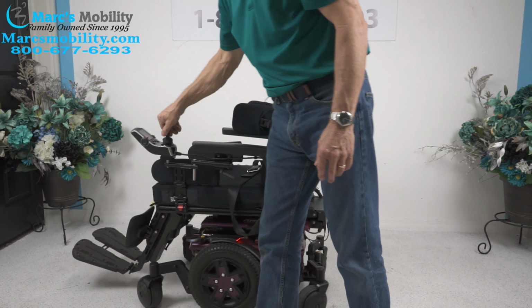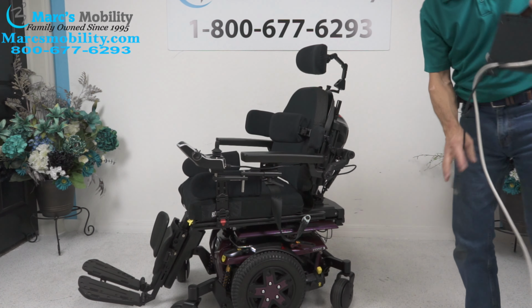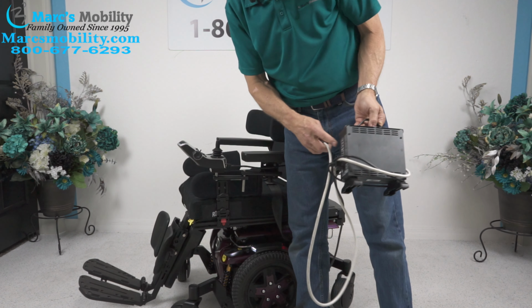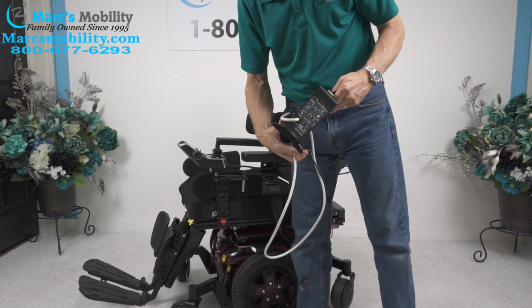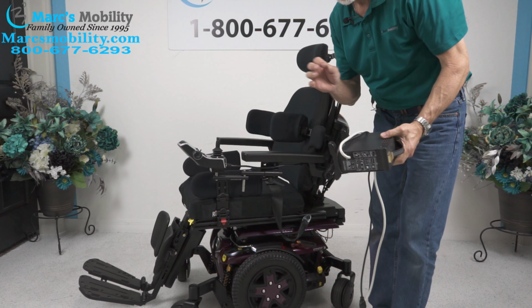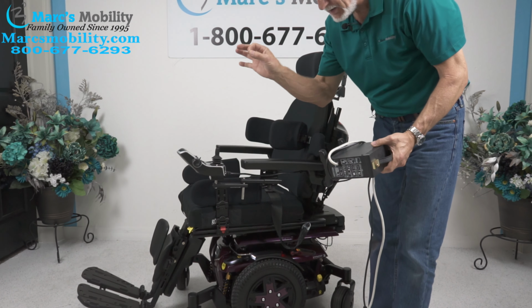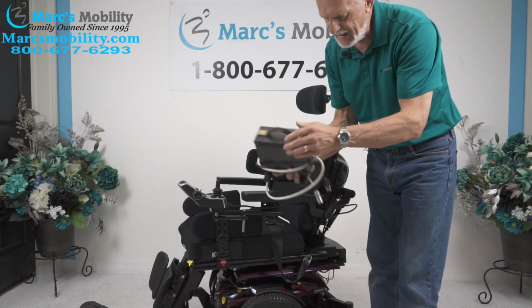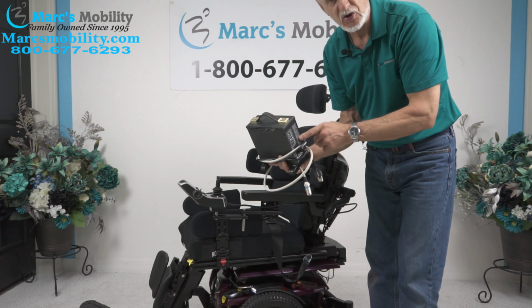When you charge this chair, you'll take your Quantum charger and you'll plug it right below your joystick right here. And as soon as the light goes from orange to green, the green means it's full. The charger will stop charging. The light will still be green on the charger, but it won't be pushing. It won't be charging. All right, let's turn the lights off on the chair.